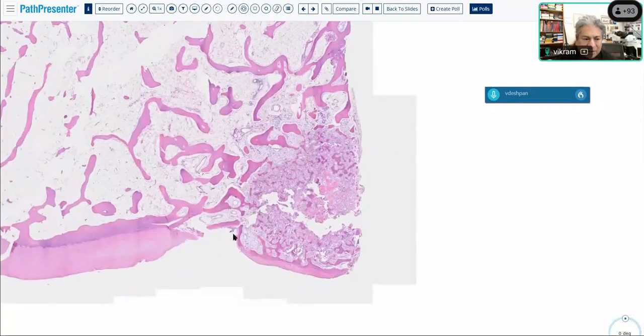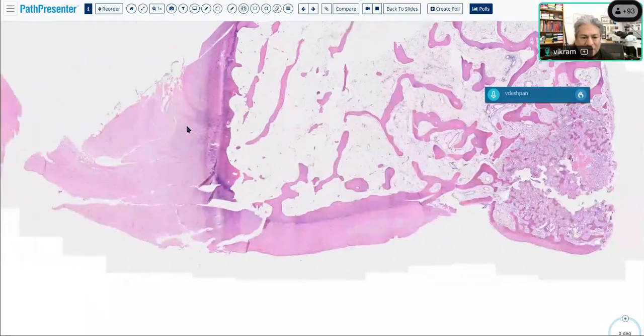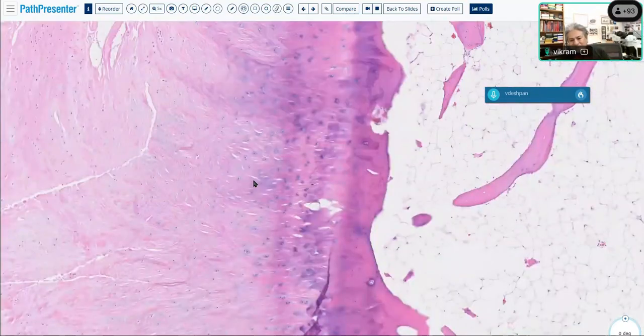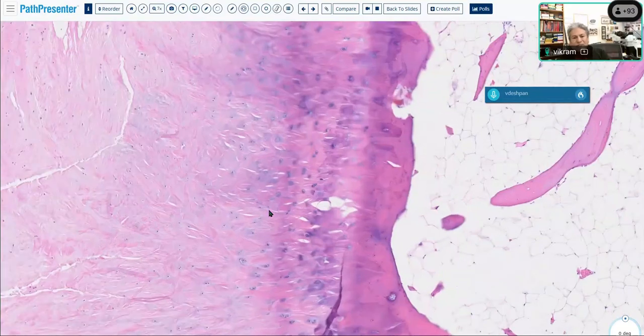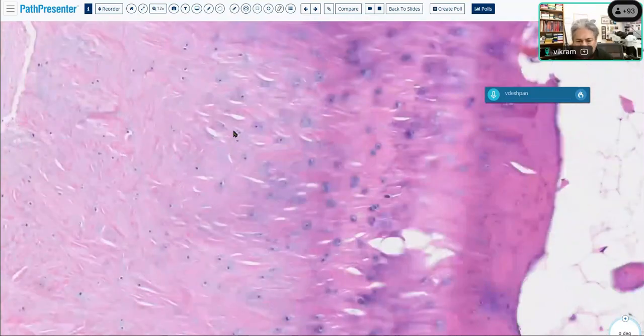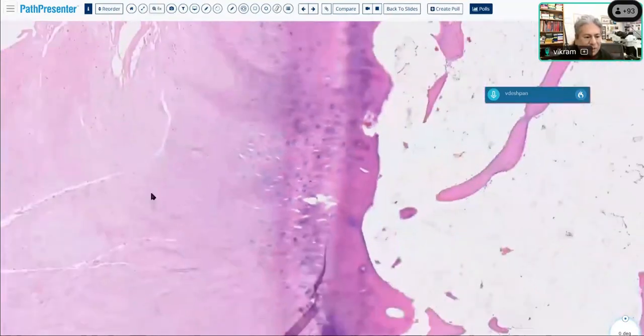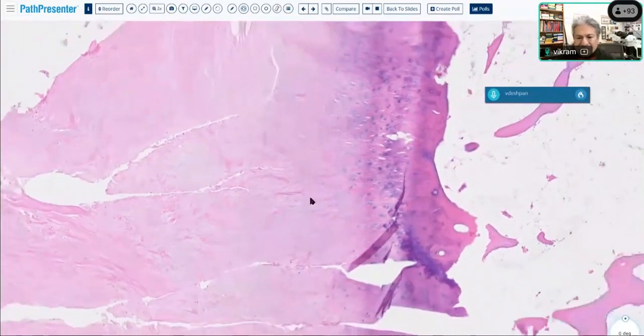Right, just to orient you, this is articular hyaline cartilage. Oh, and I did want to point out this. Does anyone know what this is? So you see this bone here, and then you see these chondrocyte-like nuclei, right? These look like chondrocytes, don't they? Space, nucleus, and then there's more collagen, like dense collagen tissue. Does anyone know what this structure is?